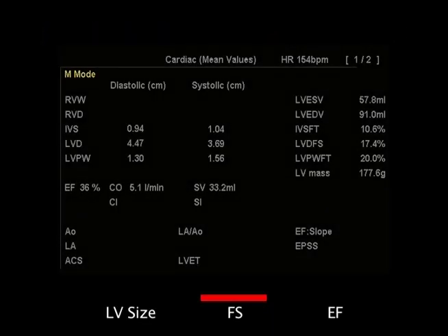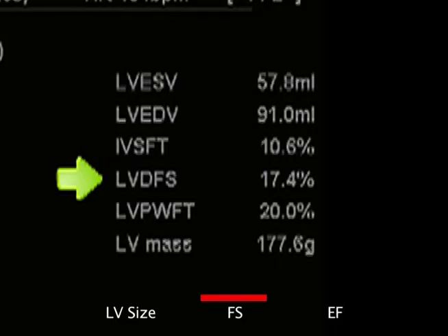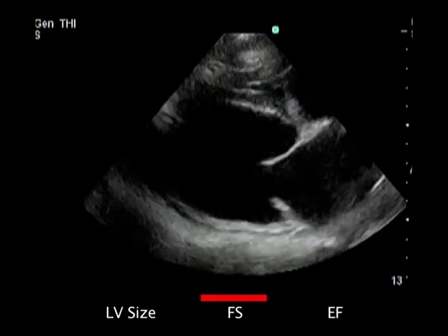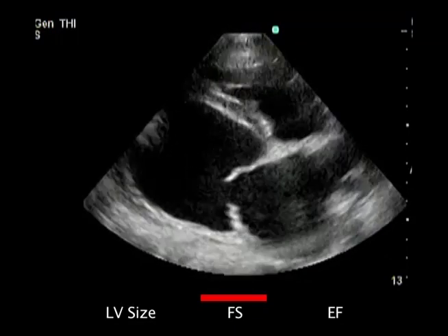Should the patient survive this severe stage of mitral insufficiency, fractional shortening will eventually drop below the minimum normal range, indicating progression to acquired dilated cardiomyopathy. So much cardiac muscle has been lost that the left ventricle can no longer achieve the normal range of contraction, and prognosis is poor.